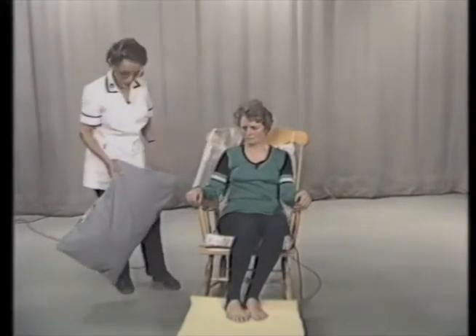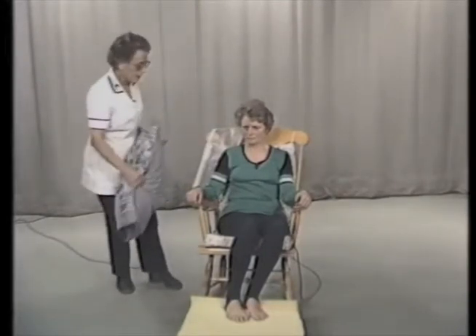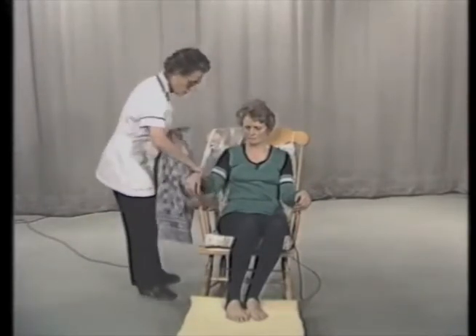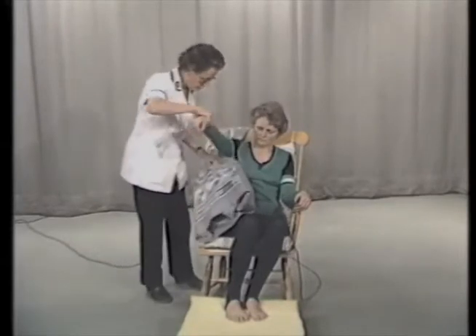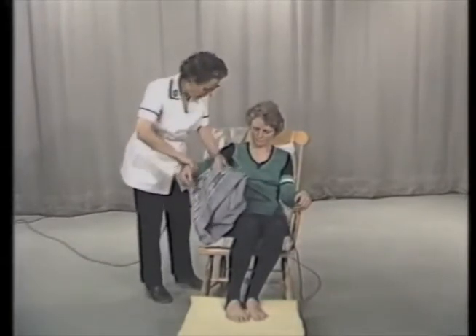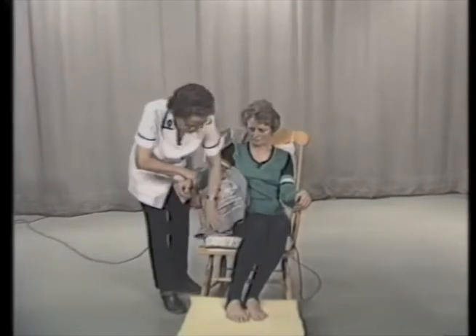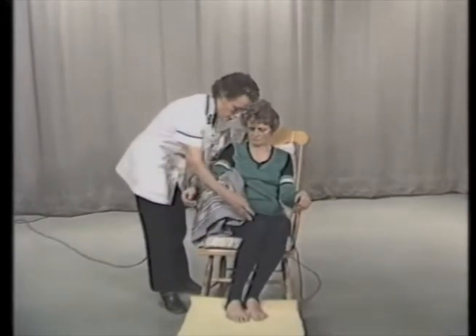But it isn't always convenient to pop the patient into lying while you put the splint on. So we teach them to do this. First of all, we put a pillow in to help maintain the arm position and to elongate the trunk. And we make quite sure that we've got the good hip pattern there.